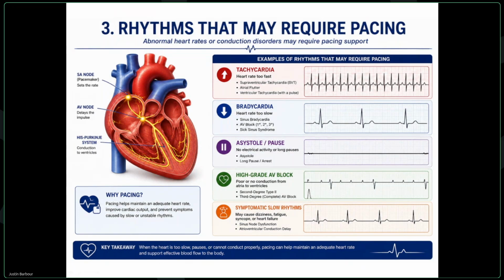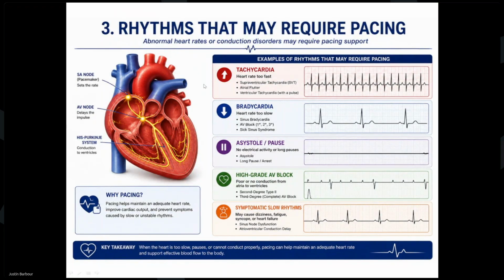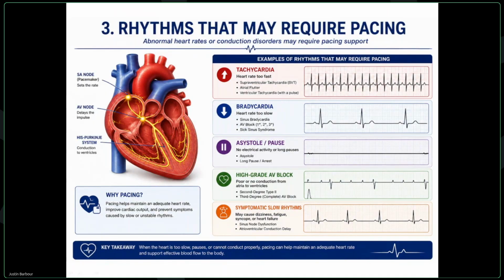It takes more energy to do transcutaneous than transvenous because you're still trying to activate this neural network that's in here. So just be mindful of that. Transvenous, where they shove a line in here and expands and they can pace out the heart internally. It's going to be more comfortable for long-term pacing for the patient. And transcutaneous on the outside of the skin, I have been told that it's painful. Trust me, I don't want to know, but that's from what I know.